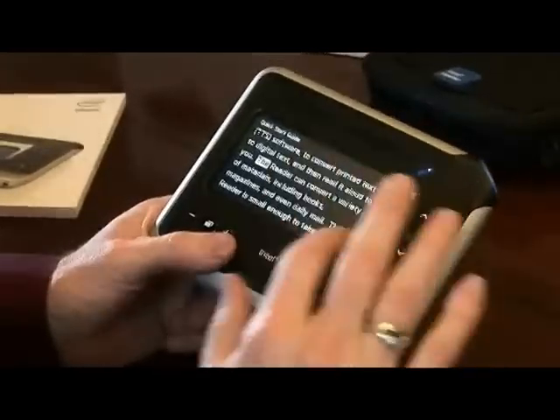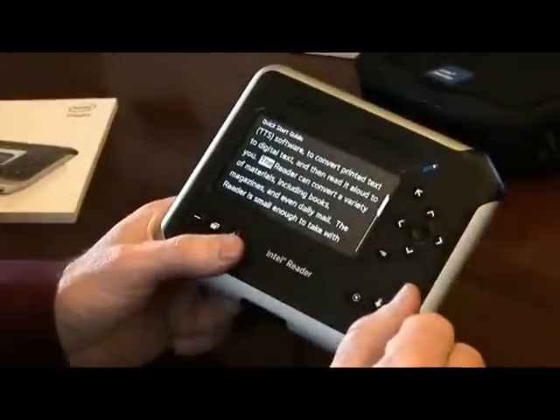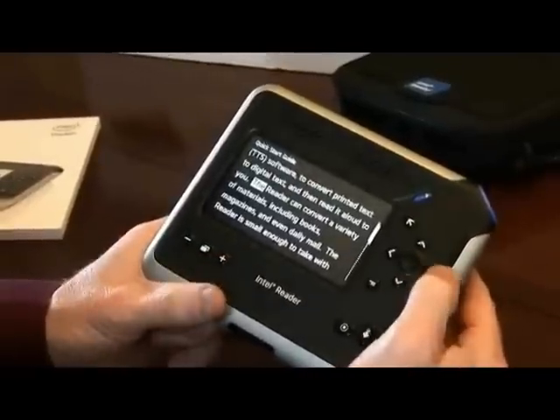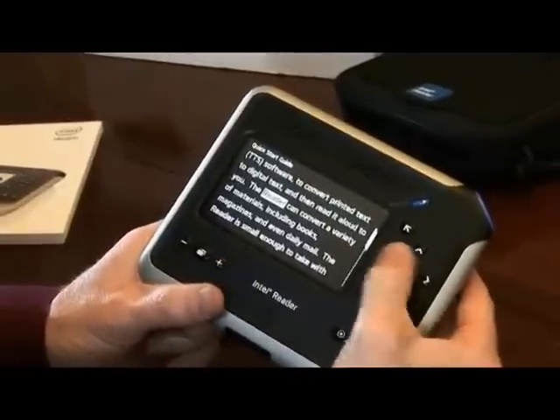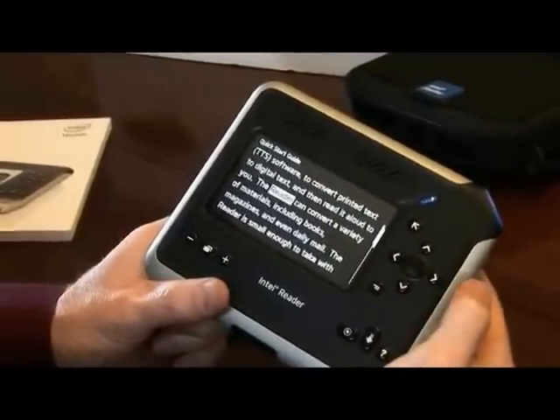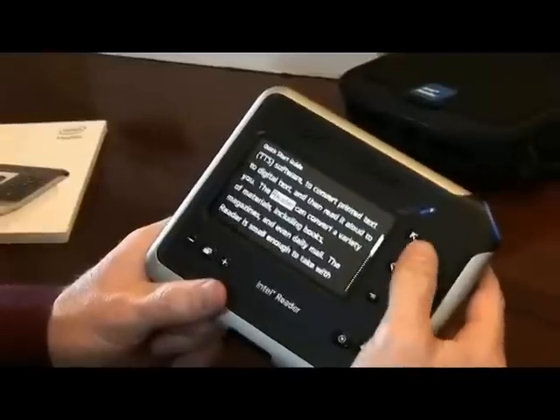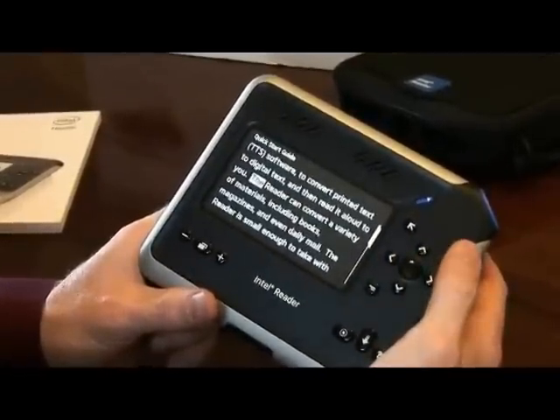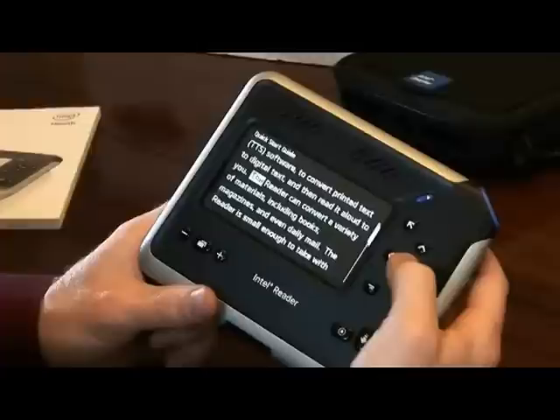A couple of things you can do when you're inside text on the device: you can navigate word by word, so you can go right and left one word. You can jump by sentence by using the up and down keys — next sentence or previous sentence — or you can resume reading by pressing the center button.